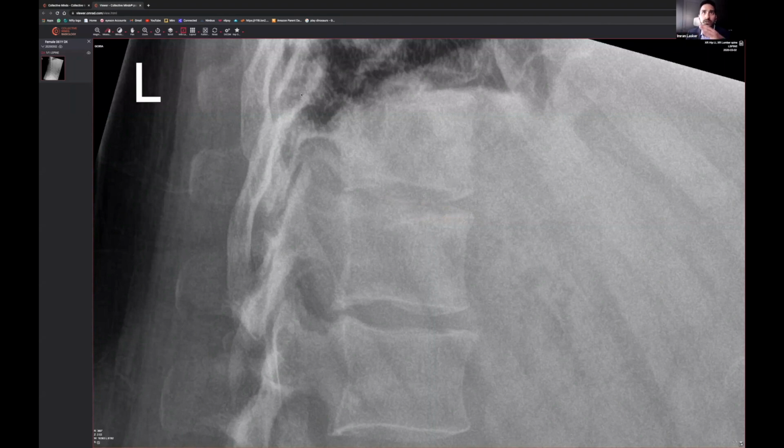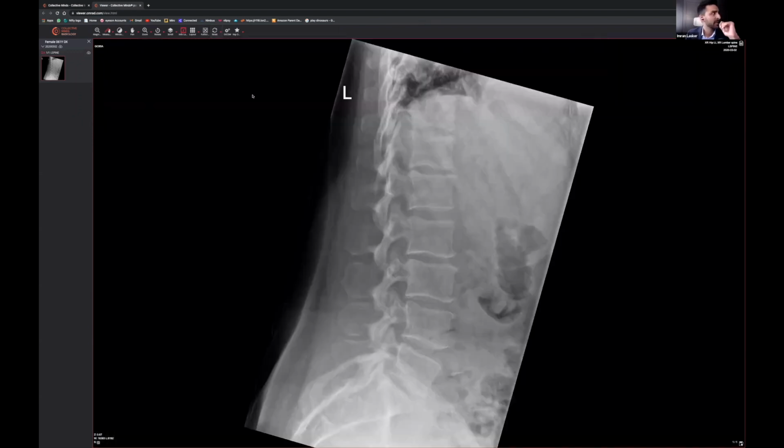Now, I know not everyone uses X-rays, and I'm going to come to your question now. Someone has asked, how often do you diagnose, I guess, fractures on C-spine and L-spine images on X-ray? So the thing is, you have to take everything into consideration, right? Sometimes X-rays are just genuinely a way of doing a quick, cursory look, just to make sure there's nothing big going on.